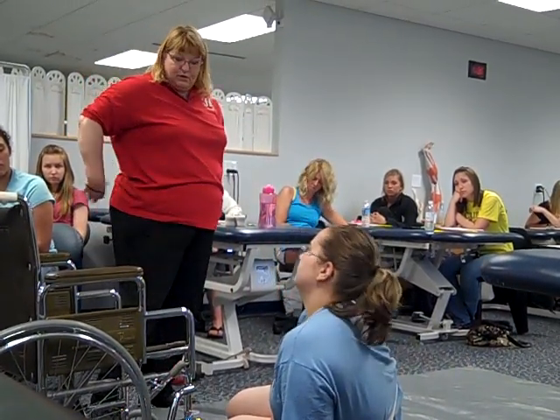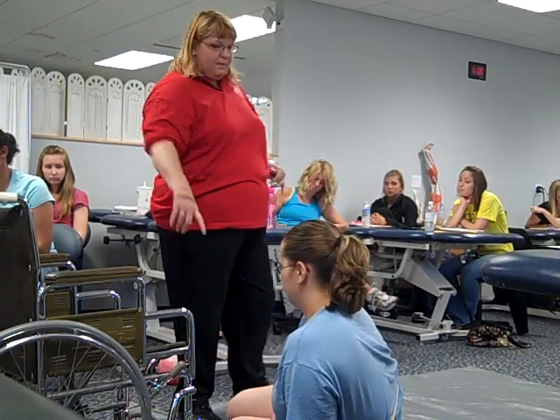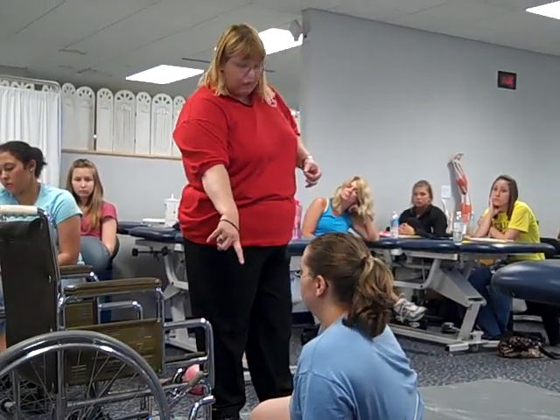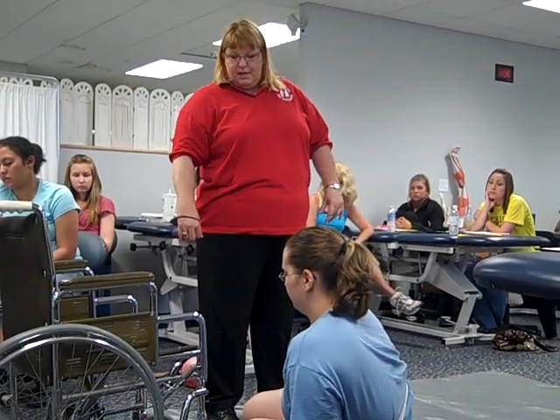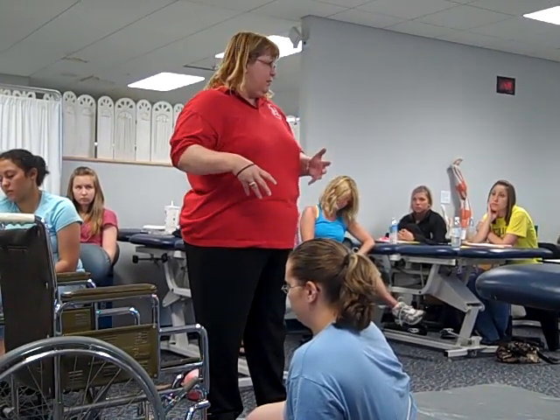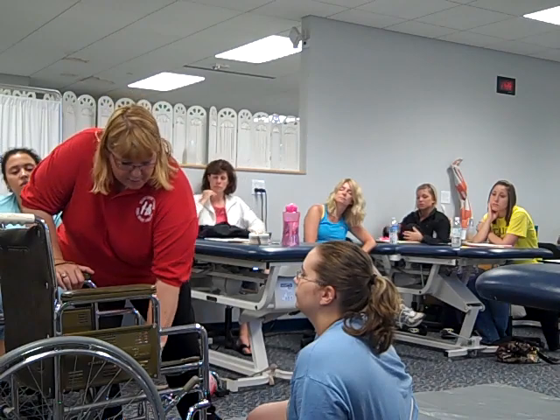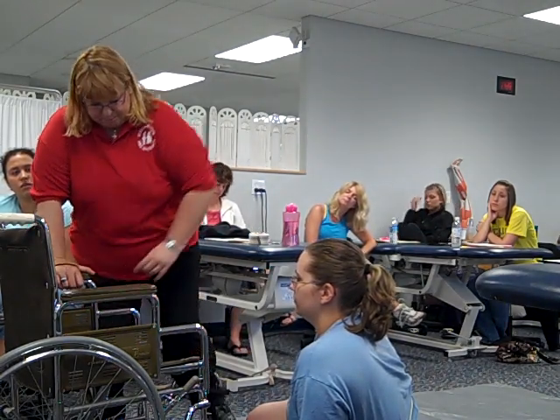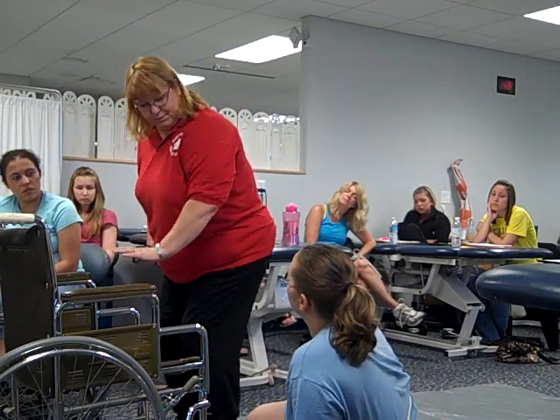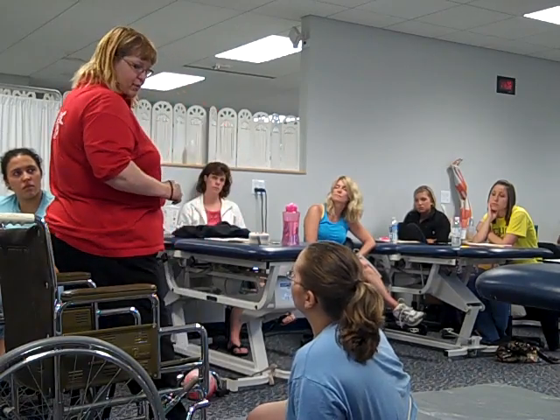Again, I'm going to make sure that the wheelchair is in a good position. Castors are forward. Wheels are locked. To get back up, her knees need to be right in front of the seat again. It's pretty hard with one hand — you have to use a lot of momentum. That lower leg can kind of help with a little bit of hip motion in there too, for getting up. She's going to need a little bit of momentum in order to get up. So for getting back up, you're going to get up and kind of let your tummy rest here so you can reposition your hand. Then you can use your leg to push a little bit. When you're in this position, you're going to use your hand and kind of lift up and turn yourself around, then move the rest of the way.